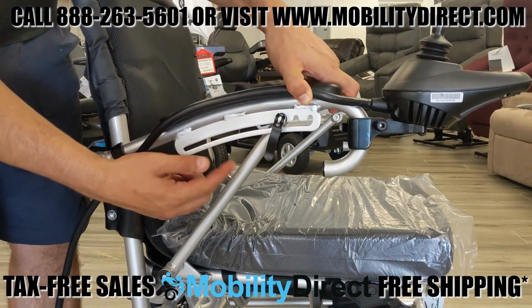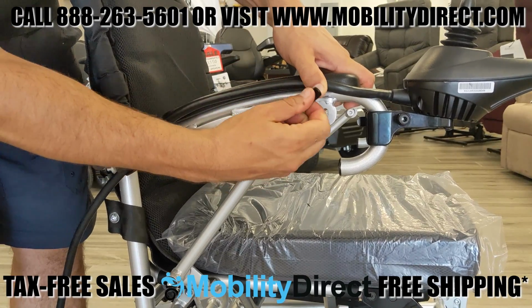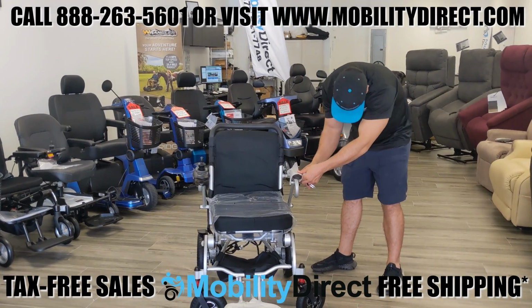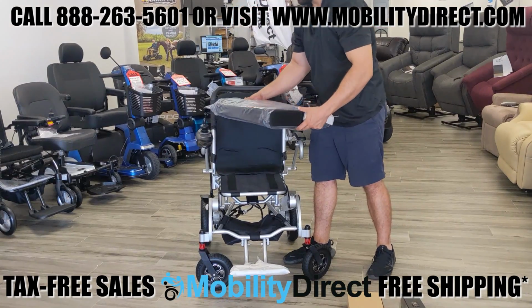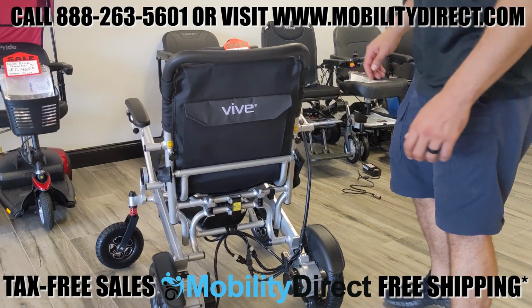Now you have the same style of bicycle clamp to adjust the tilt of the armrest. This technically allows you to raise the armrest a little bit by tilting it up. And you want to lock it into place when you find that desired height for each armrest. It does work on the left and the right side. And we're just removing some styrofoam sheeting and some packaging here from both the armrest and the seat itself, which does have Velcro on the bottom, just 2 strips to keep it secure.